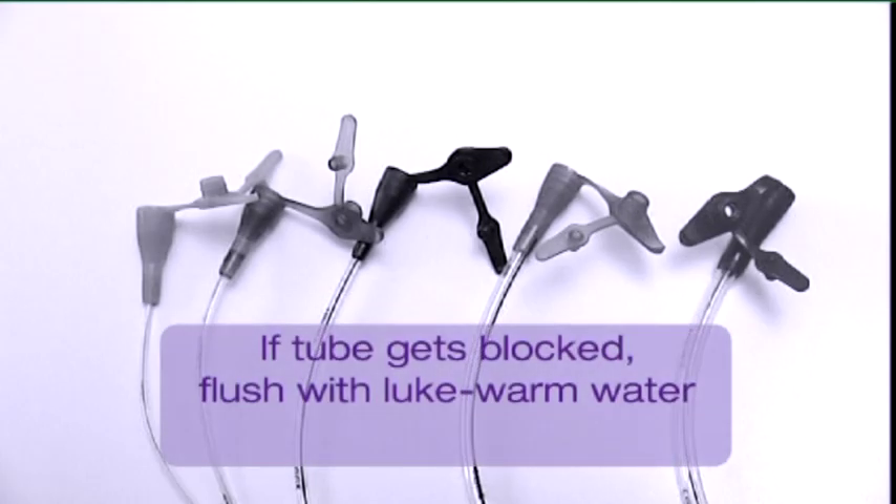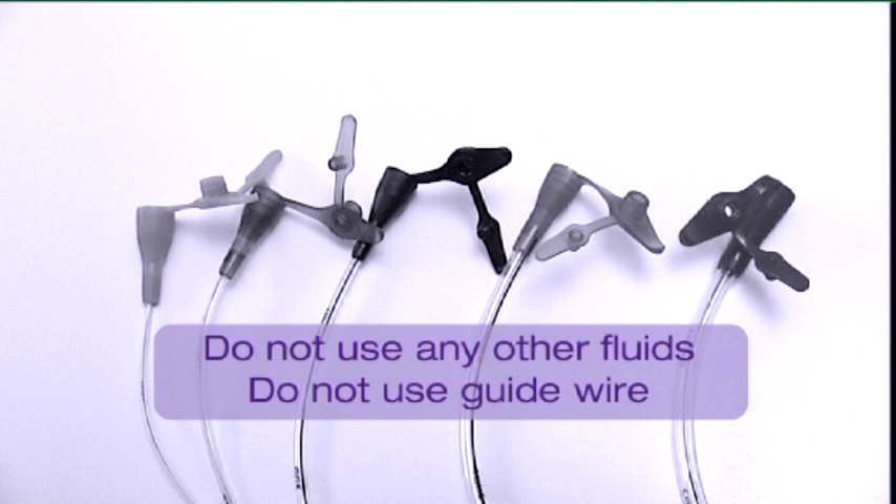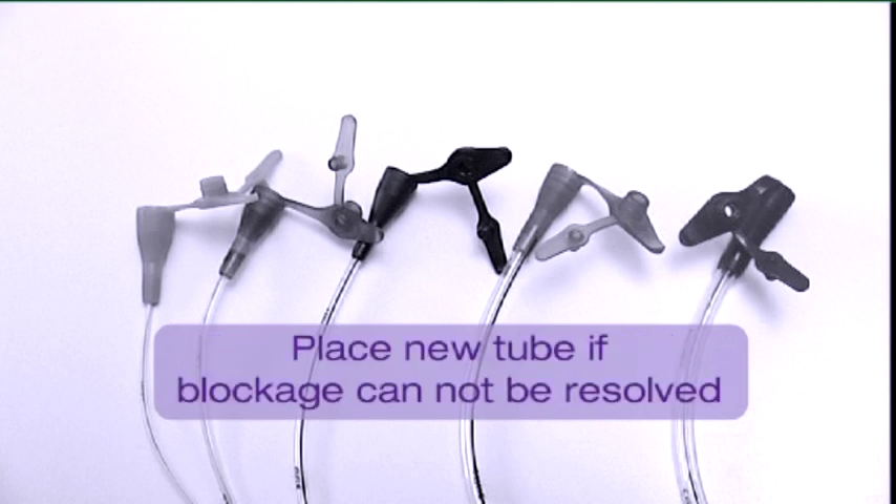If the tube does get blocked, flush the tube with lukewarm water. Do not use excessive pressure to prevent tube rupture. Use a syringe larger than 20ml and gently squeeze the tube between your fingers along the length of the tube. Do not use any other fluids to flush the tube. Never reinsert a guide wire to solve tube blockage as this may cause perforation of the gastrointestinal tract. If tube clogging is not resolved, remove the tube and place a new one.